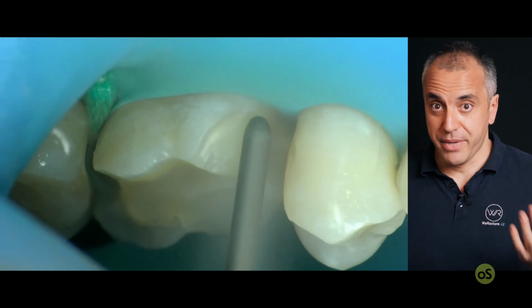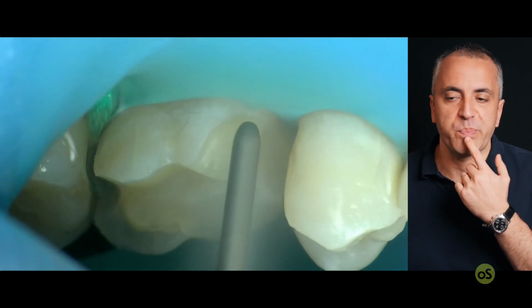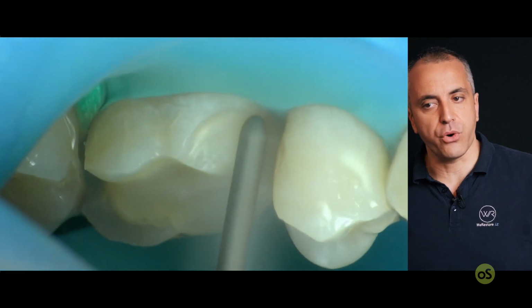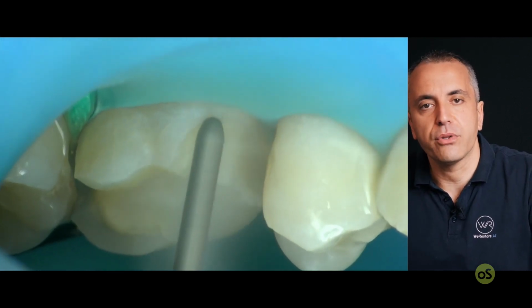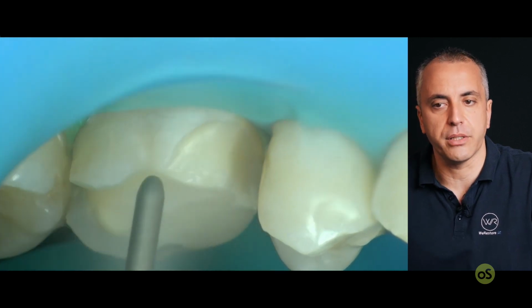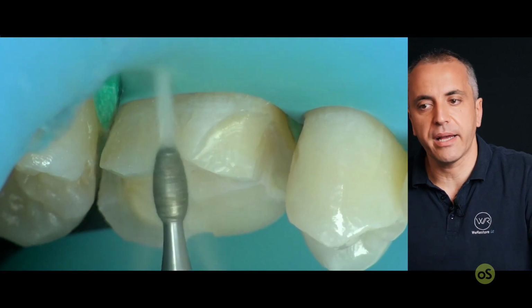Also some people, also the second molar, of course, there are people that just show the lower teeth, so it's important to select the proper design also from an aesthetic point of view, considering the smile line of our patients. So this is the preparation of the mesiobuccal connection.